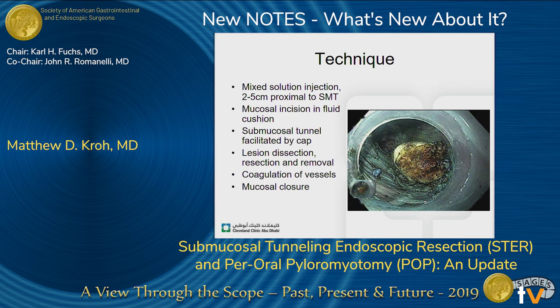So the technique involves a submucosal injection, access to the submucosal plane above the muscular layers. The submucosal tunnel is facilitated by a cap. The lesion is dissected, removed, coagulation of vessels, and mucosal closure.